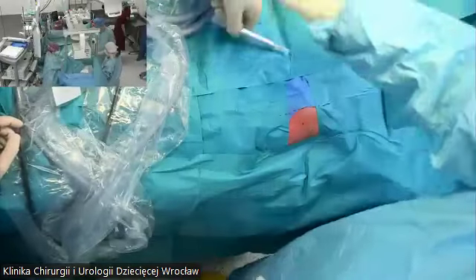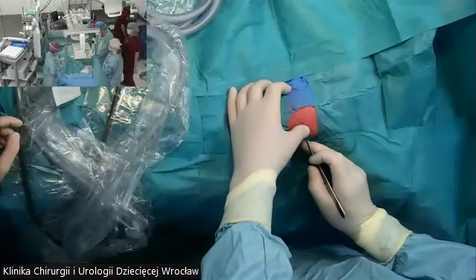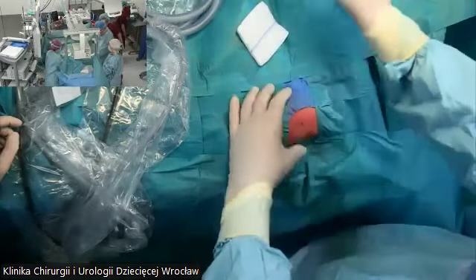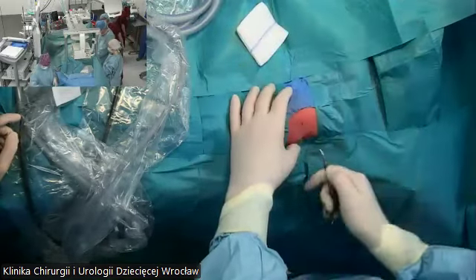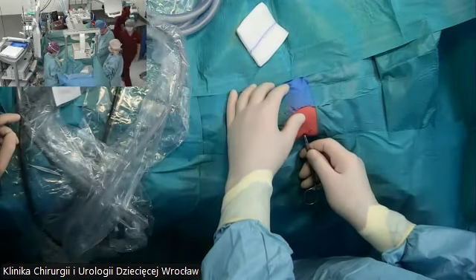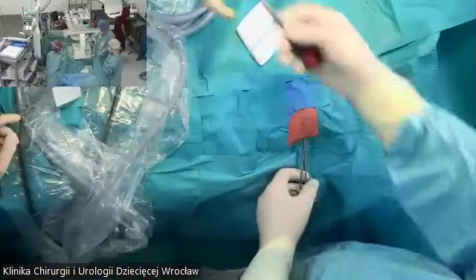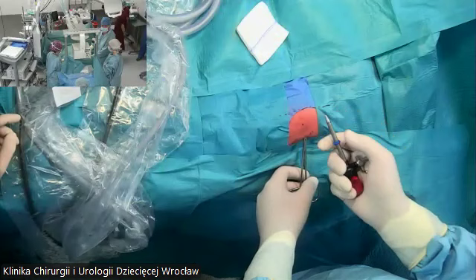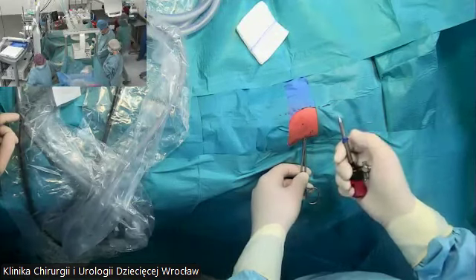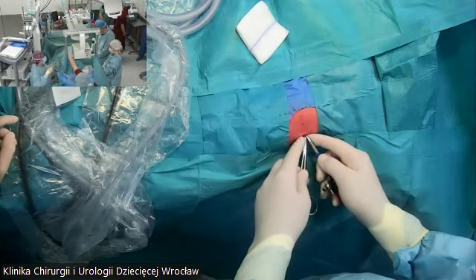Okay, so we start with the skin incision with the 11 blade. That's perfect for every endoscopic procedure. I like it. Then we put a small hemostat into the chest, so I don't use a Veress needle. Okay, so we are already in the chest. And then we use a 5 millimeter trocar with a blunt tip. As you can see, there is the rubber around the trocar just to fix it to the skin.